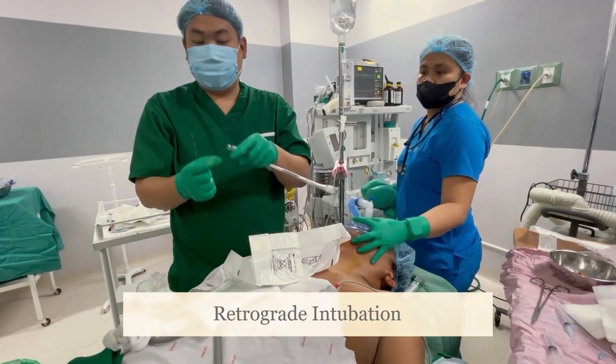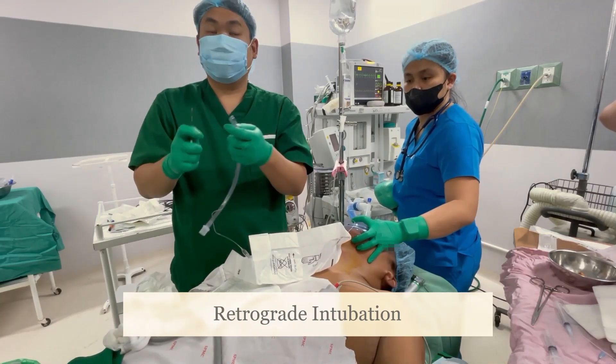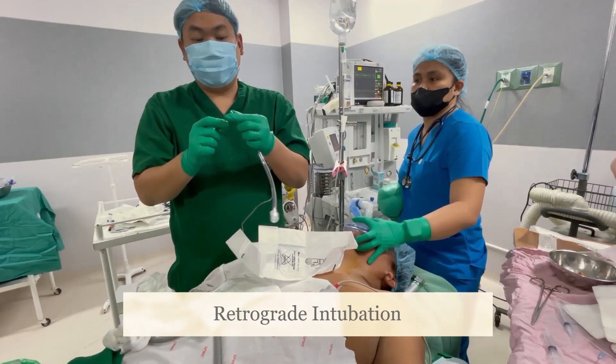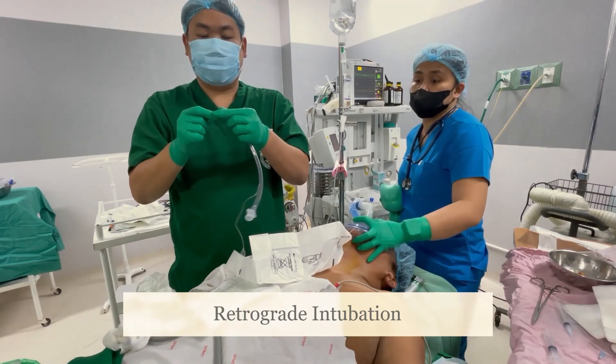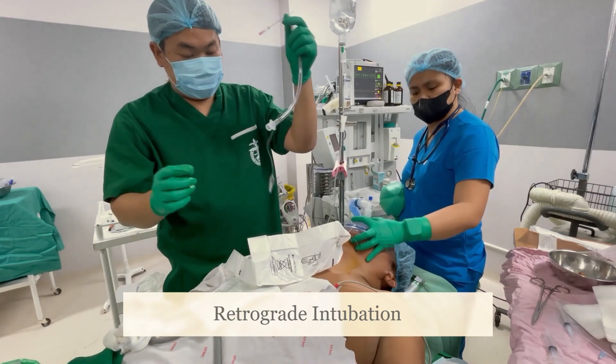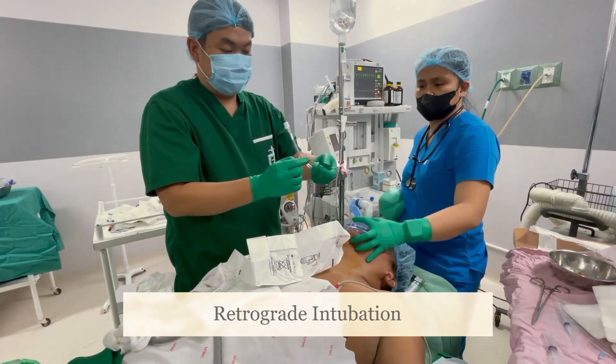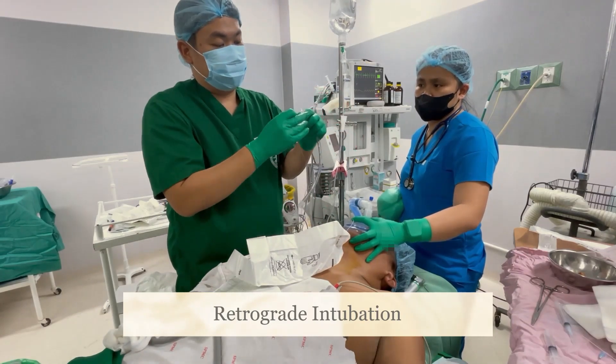The epidural catheter can be tied at the Murphy's eye of the endotracheal tube. To lessen hang-ups, puncture the ETT near the end with the two-way needle and thread the catheter in. Remove the needle and tie the catheter. Pull the other end of the epidural catheter to intubate.